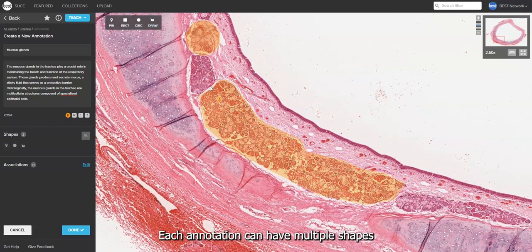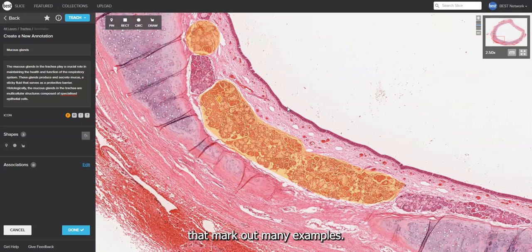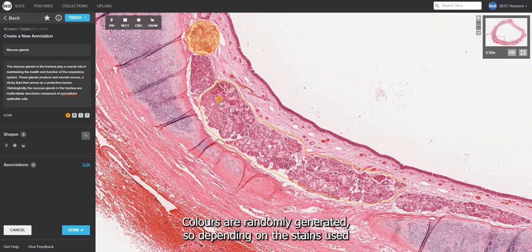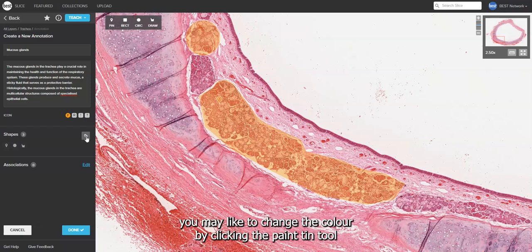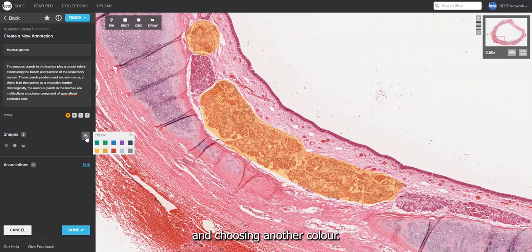Each annotation can have multiple shapes that mark out many examples. Colours are randomly generated, so depending on the stains used in your slide or other annotations you've already made, you may like to change the colour by clicking the paint tin tool and choosing another colour.